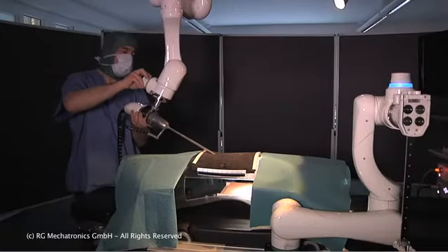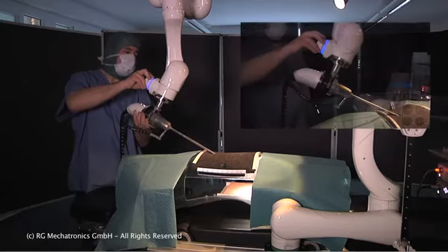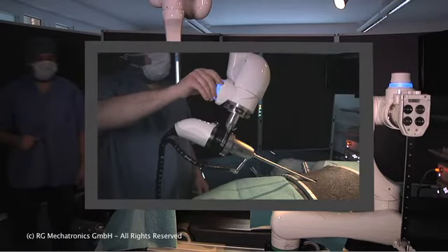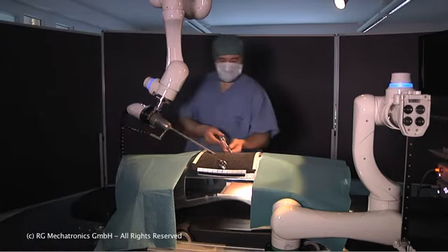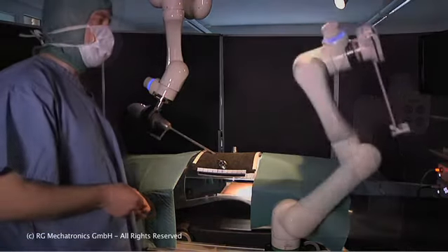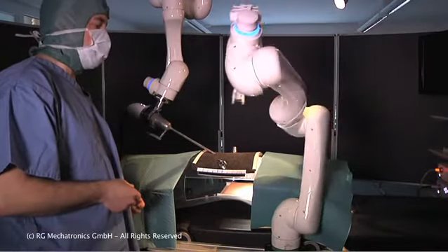and now the position can be adjusted via the RoboCommander. Fine adjustment can be performed with the ring. Now the trocars are introduced to the other two ports in the body. And the robot drives to its preparation position.